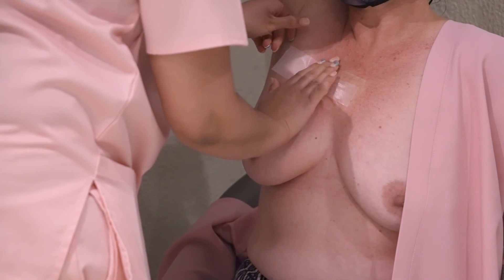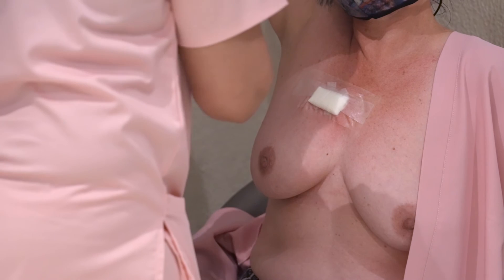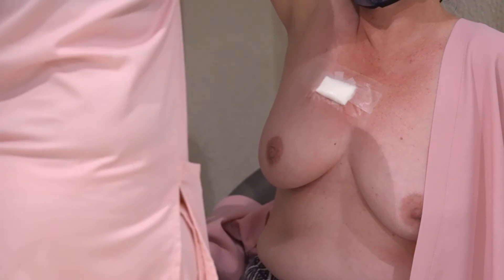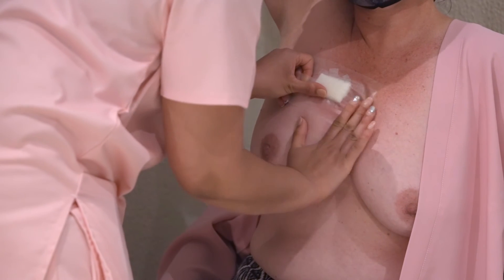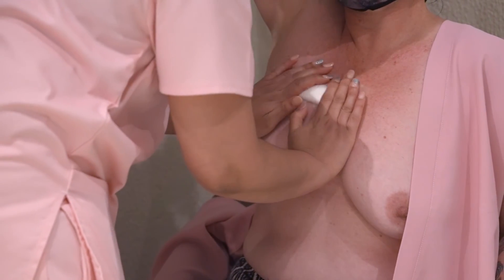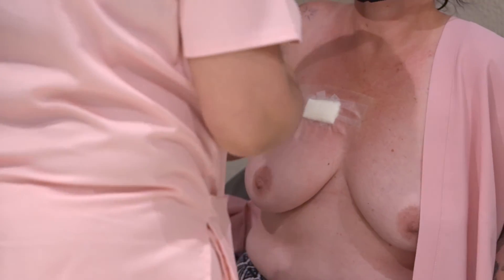Wound strips and sterilized gauze are placed over the site and protected with surgical tape. The patient is asked to remain seated and relaxed with an ice pack for 10 minutes to continue compression and minimize swelling. A compression bandage can be applied should it be required for 24 hours.